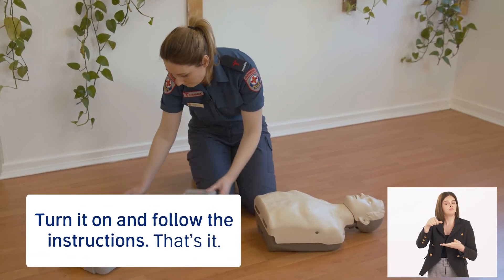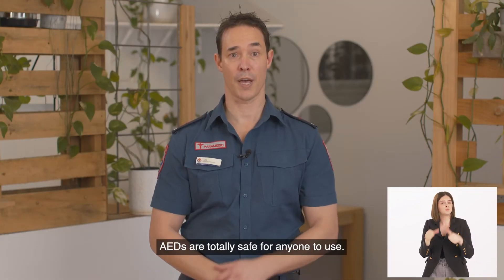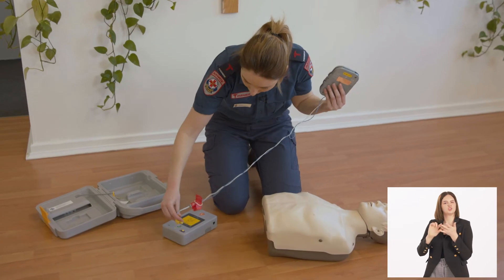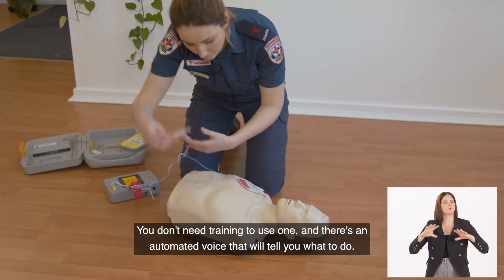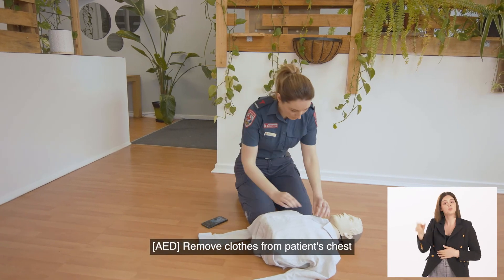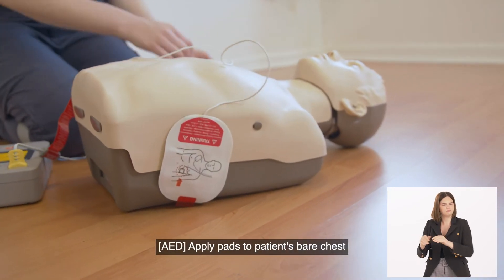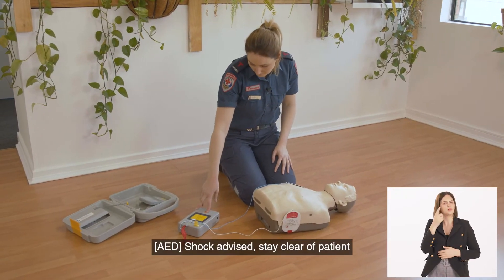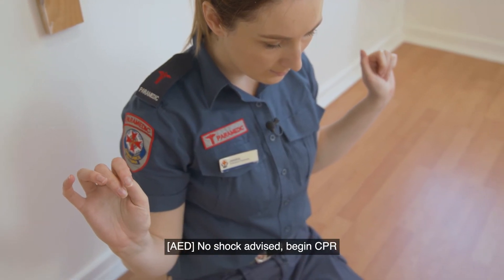Turn it on and follow the instructions — that's it. AEDs are totally safe for anyone to use. They analyse the patient's heart and only deliver a shock when needed. You don't need training to use one, and there's an automated voice that will tell you what to do. Some of the things it will tell you are: to remove clothes from the patient's chest, where to put the pads, when to move away from the patient — 'Shock advised, stay clear of patient' — and when to keep doing compressions — 'No shock advised, begin CPR.'